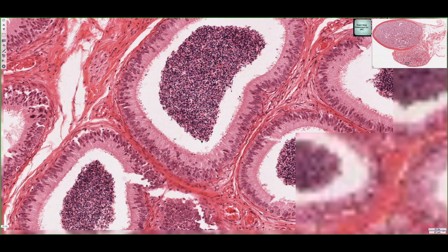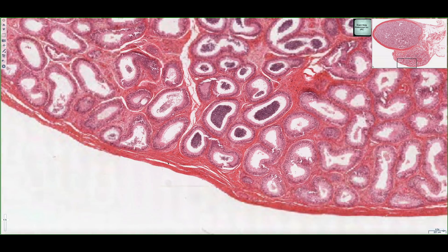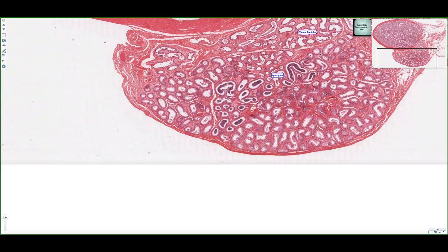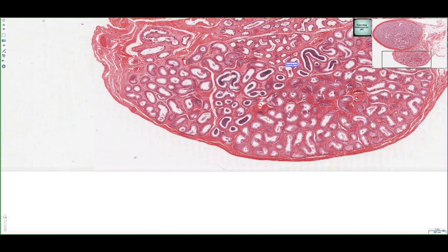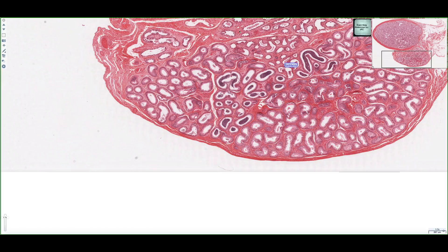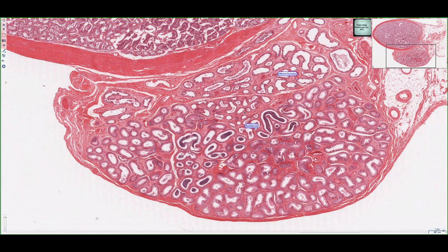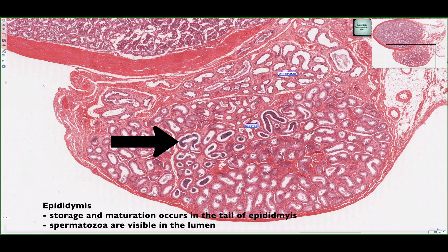Zooming out, we can see both regions clearly: the efferent ductules have a distinct scalloped appearance of their lumens, whereas the epididymis has a smooth pseudo-stratified columnar epithelium. Even in this gross view, we can see that the epididymis is where storage and maturation of sperm occurs. In conjunction with the autonomic nervous system, sperm are propelled through the vas deferens towards the ducts for seminal emission.